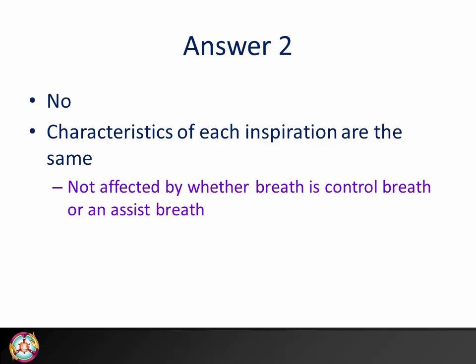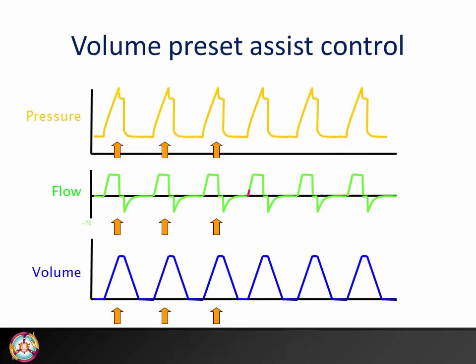No. Inspiration can either be initiated by the ventilator or by the patient. However, the same tidal volume is delivered in the same time, regardless whether the breath is initiated by the ventilator or by the patient.